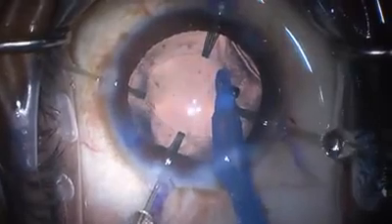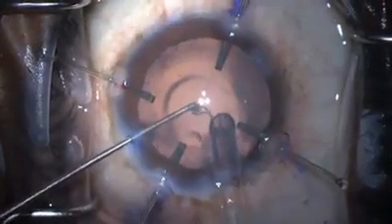There's a very dense posterior capsular plaque here, which is common in these white cataracts in young folks. And so we get the visual axis clear, but still you can see the bag is very loose over in this area. So we're going to place a capsular tension ring.